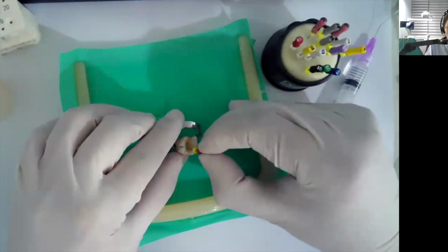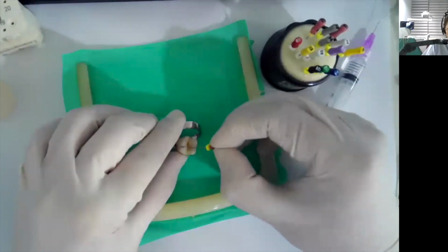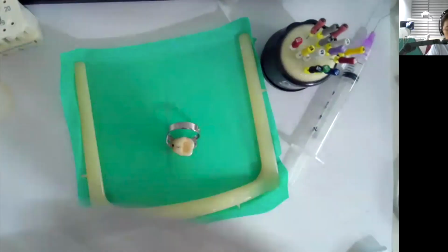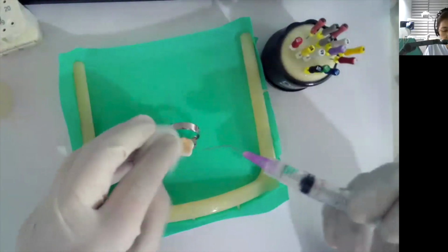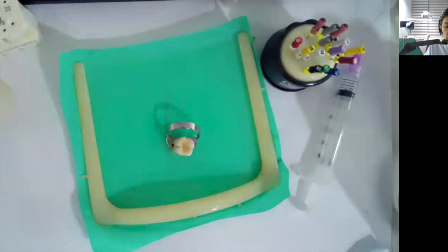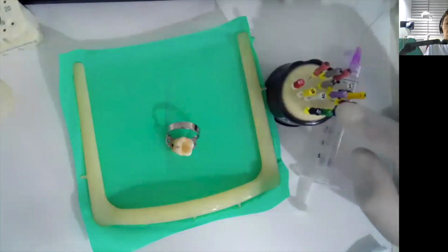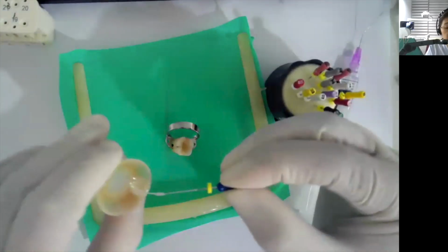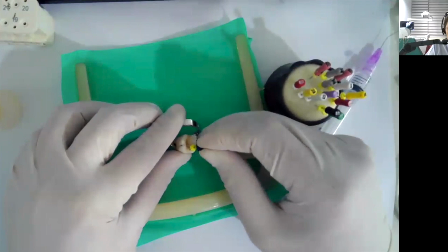So usually I work one canal at a time. Then I'm now ready to do the step back. I will irrigate first. Okay. Next, I'm ready for 30, 35, and 40. This is now step back. Put some EDTA. I can feel that the canal is smooth.